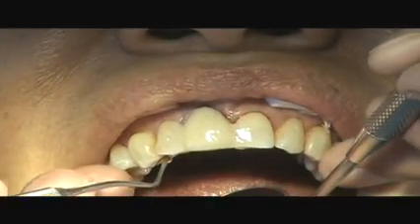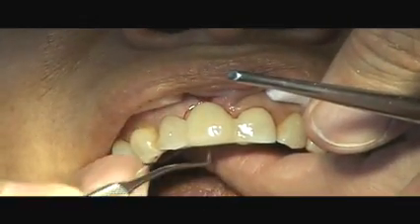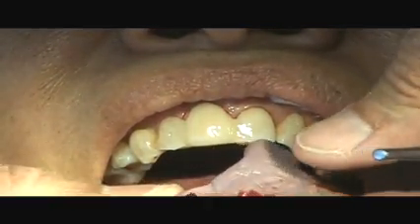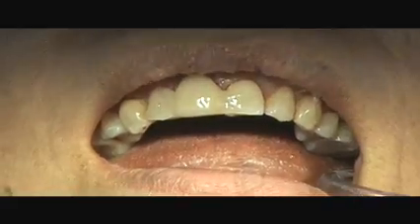The stent is removed prior to finishing by simply inserting an instrument such as a porcelain filling instrument or the like between the tooth stent interface, lifting lingually from the gingival margin of the tooth stent interface, rotating with the fingers and removing.